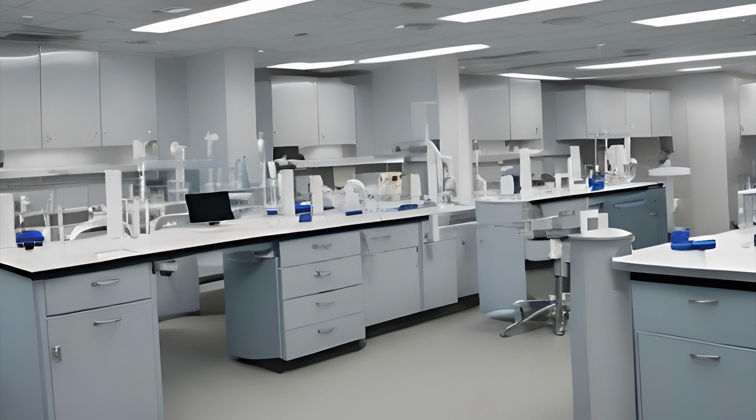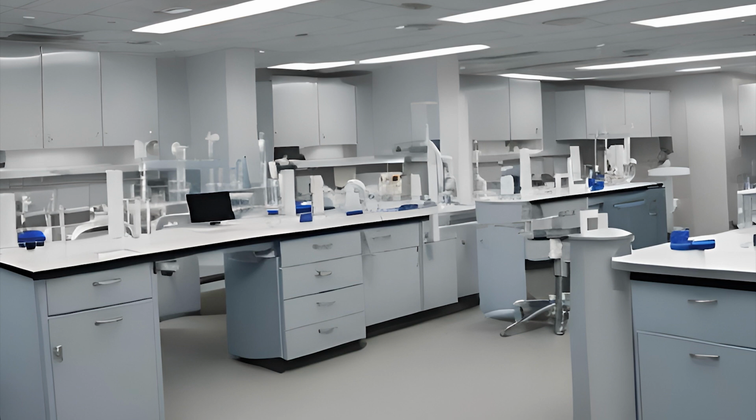If you have a light-sensitive specimen, your most common example being bilirubin, you want to transport it in something that will protect it from light. Whether that tube is wrapped entirely in tinfoil, which is a common option for labs that don't have specific tubes for this purpose, or you take a brown glass tube and use that to protect it from light. We call them amber tubes. Those can also protect bilirubin from light. If you do not do this, the level of bilirubin in your sample can go down by up to 50% within 1 hour of the time it's drawn.